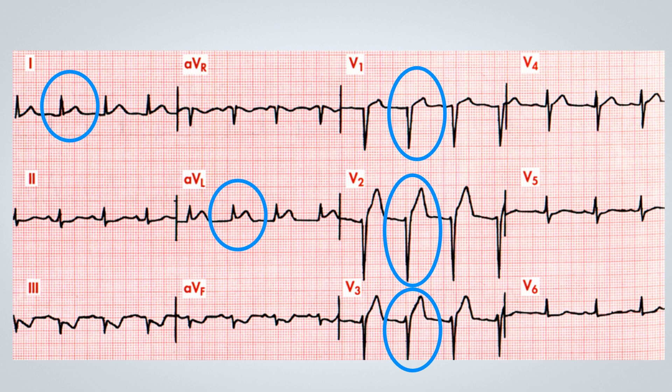Along with this, when we have localized elevation in a specific wall — in this case, the anterolateral wall — we usually see depression in the opposite wall, as if it were a mirror image, when it results from ischemia rather than early repolarization or another cause. What can we observe in the inferior wall? We see an elevation in the anterolateral wall and a depression in the inferior wall. Thus, this ECG strongly suggests an acute myocardial infarction.